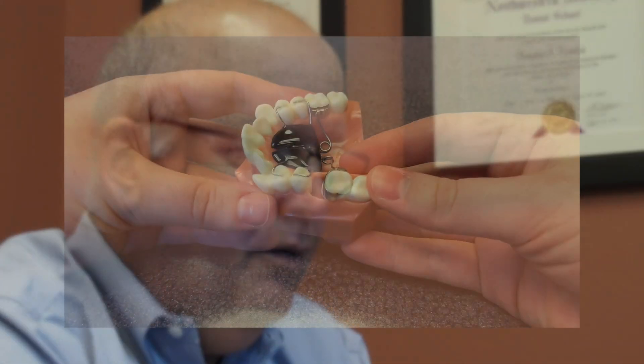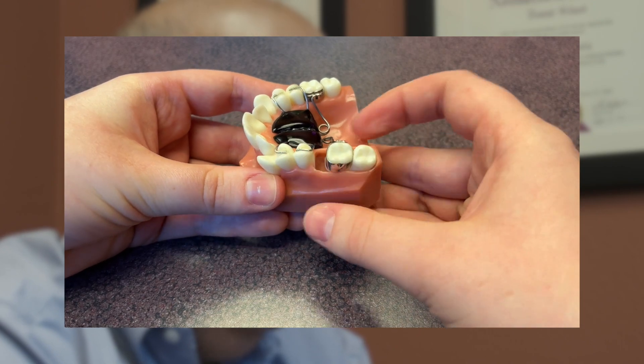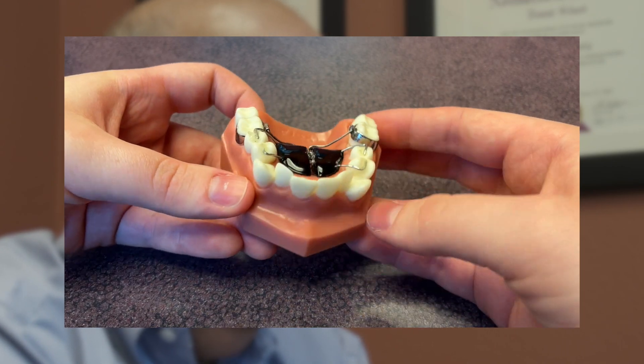Braces are glued onto the teeth; occasionally there's a band or ring around a tooth, but for the most part braces are glued on. Other fixed appliances might be something to help push back a molar for bite correction — a fixed appliance that works to distalize, or push back, the molars.